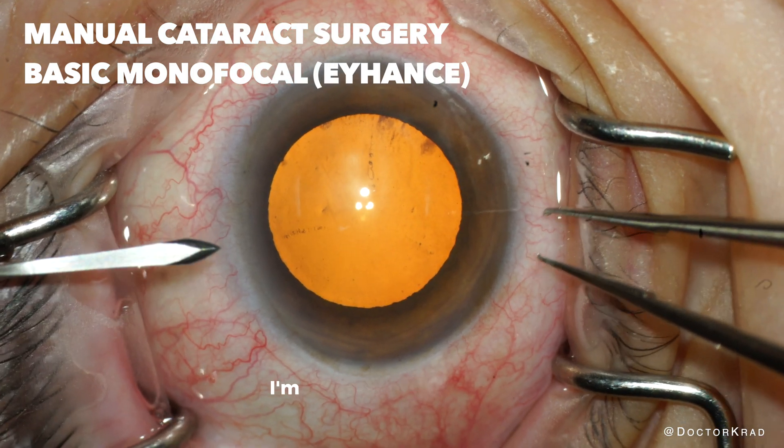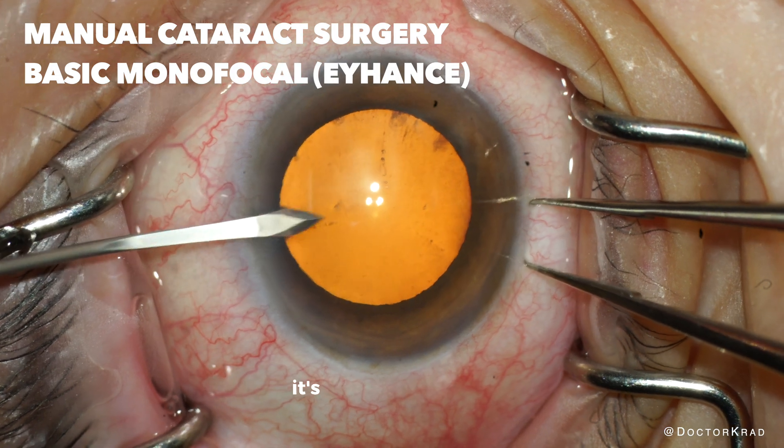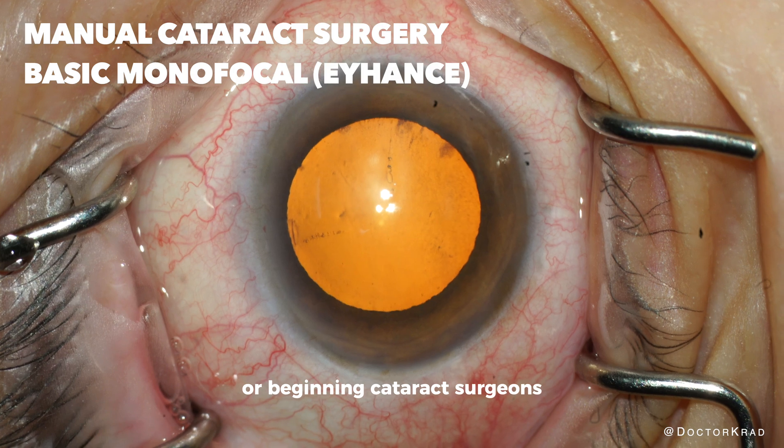Hi everyone. In this video I'm going to go over a basic manual cataract surgery, unedited. It's meant for people who are just learning about cataract surgery or beginning cataract surgeons.